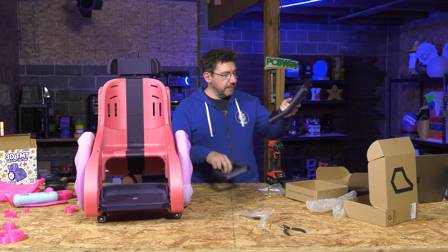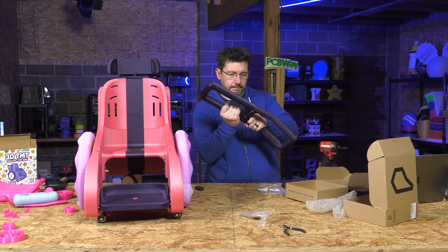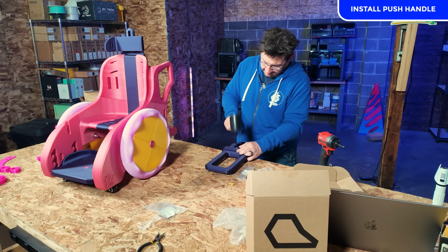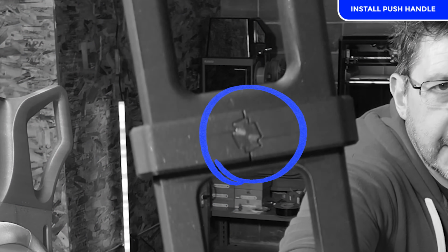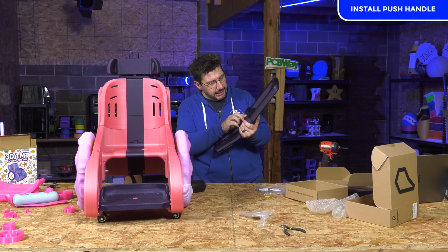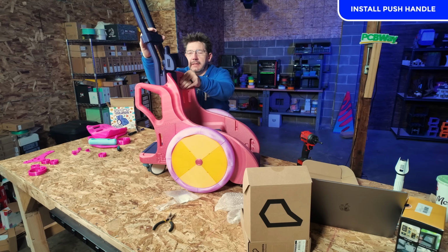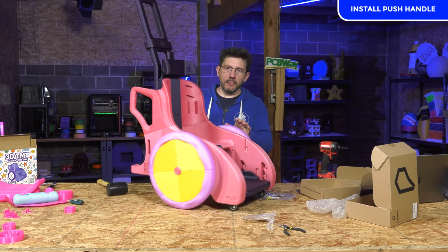Now we've got the push handle. This prints in 2 parts. And it just goes together like this. Super easy. This has these pieces that go over it. So you can see this split. There's a little split in it. It's not bad. It's not gonna come apart. It's just a tiny, tiny little split. But these are gonna go on the back, down into place. So, whoa, that's tall. So now a parent can push.